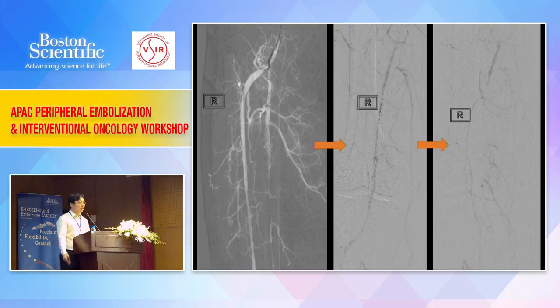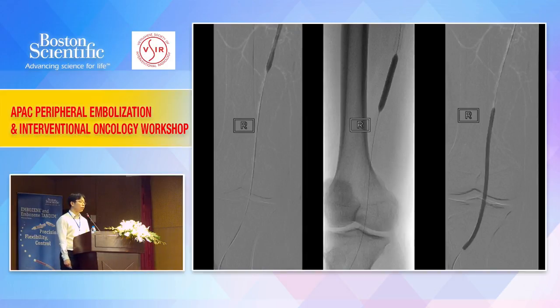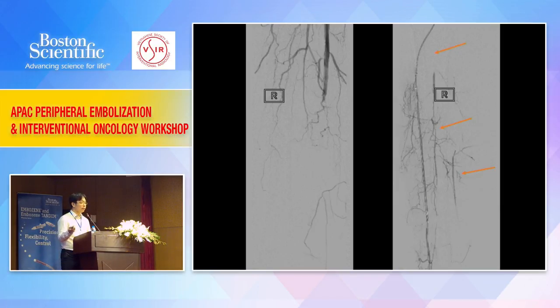But as with most things, unfortunately for this patient, very quickly the entire occluded segment, which we just treated with RTPA and did a pulse spray, got occluded again. And fortunately or unfortunately, these are again very soft clots. We go back and do mechanical thrombectomy again, suck out all the new clots which just formed. So it's really simple to suck it out. Do the balloon angioplasty and then see how is the result.